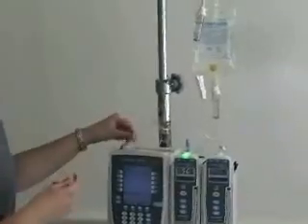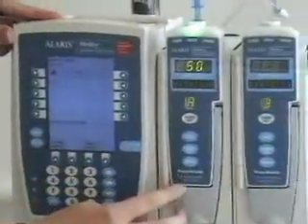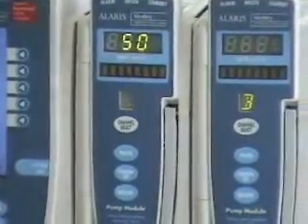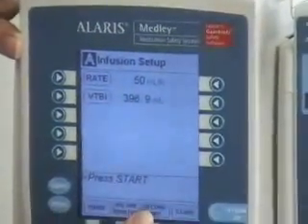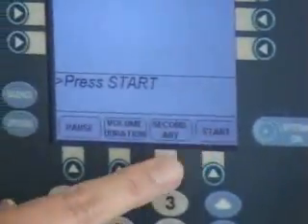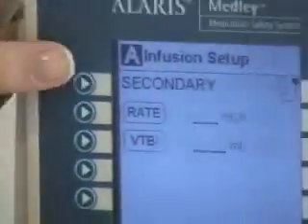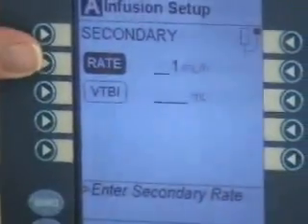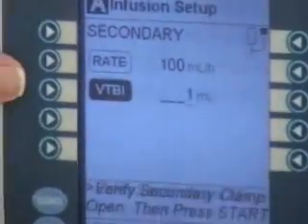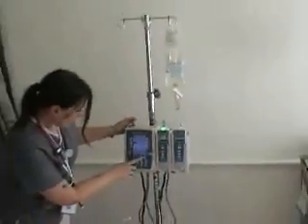Now we're ready to program our secondary line, which is our piggyback. We have two channels — on the Alaris pump, push channel select to choose channel A. We have our rate and volume to be infused, but we're adding a secondary. At the bottom you have options: pause, volume duration, secondary, and start. Since we're adding a secondary line, push secondary, then pick our rate — it's been ordered at 100 mils per hour and the volume to be infused is 100 mils. So we're going 100 mils per hour with 100 mils of solution, then it will ask us to start.